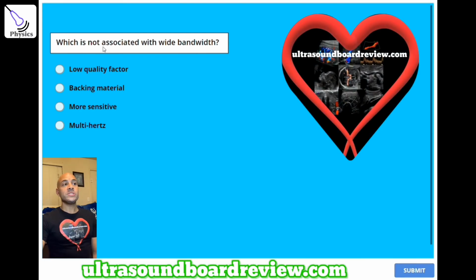Question 21. Which is not associated with wide bandwidth? A. Low quality factor, B. Backing material, C. More sensitive, or D. Multi-hertz?